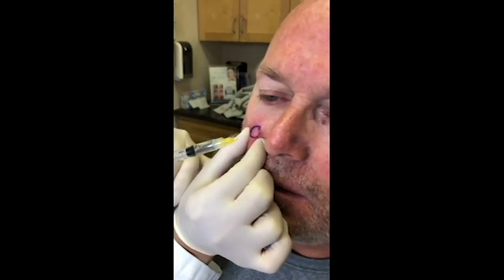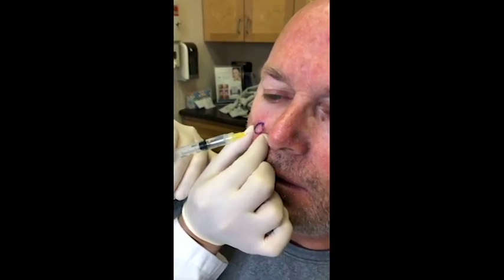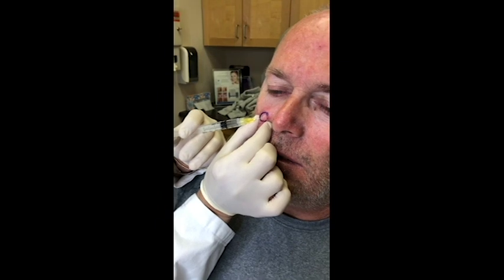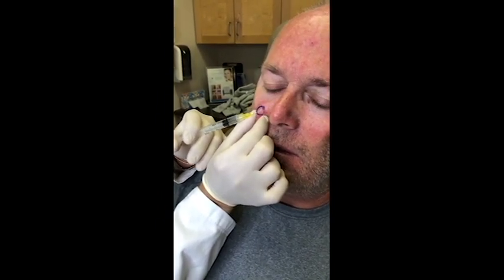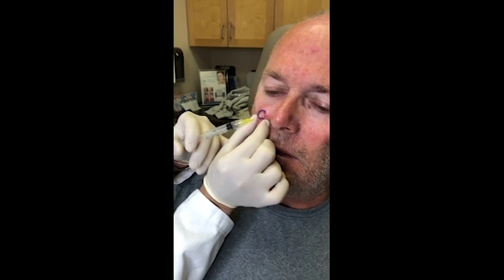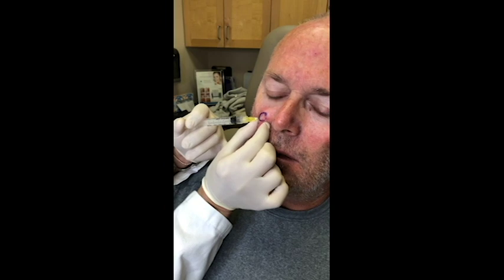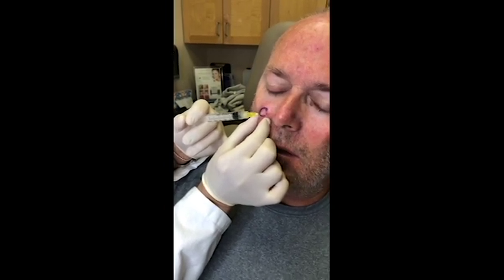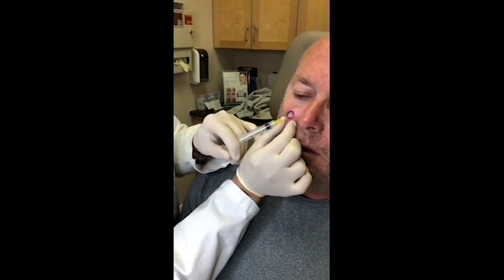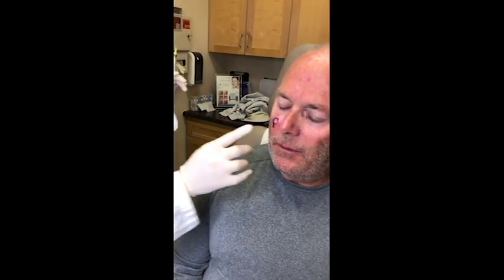Then we numb the location to take our specimen. With the specimen, we try to clear it where we feel clinically where the margin is. A little pinch here — sensitive for a shot. After the area is numb, we take the first specimen. We mark the specimen according to the upper portion, left, right, so we delineate it underneath the microscope. As we're looking at it under the microscope, we're looking to see where the tumor goes — left, right, up, or down. If the tumor goes only to the middle portion or only into the upper portion, we only follow the tumor there, minimizing the excessive tissue to be removed completely circumferentially around the lesion.